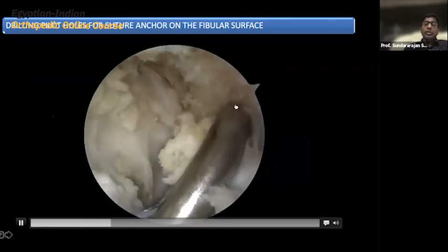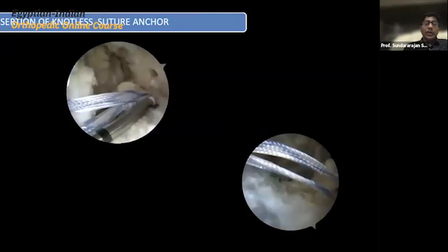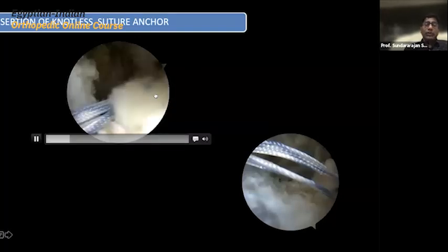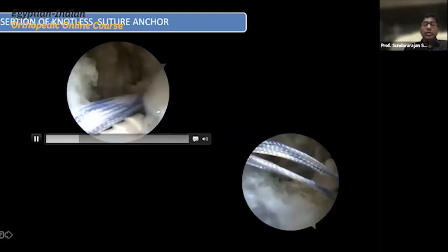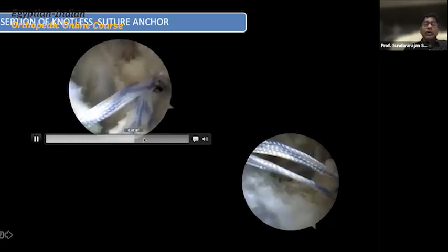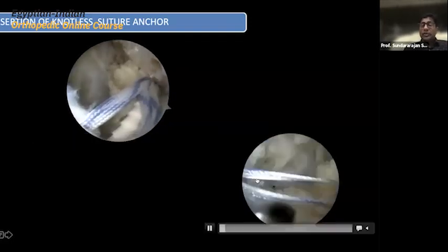Here I'm using the cannula for my drill. And what I do is use the knotless anchors to attach these cinched tied knots from the ATFL to the footprint. I use one very lowermost here. You can see that there are two holes over there. So I put two push lock anchors here, and you can see that I slowly hammer that, then it goes and attaches over there.